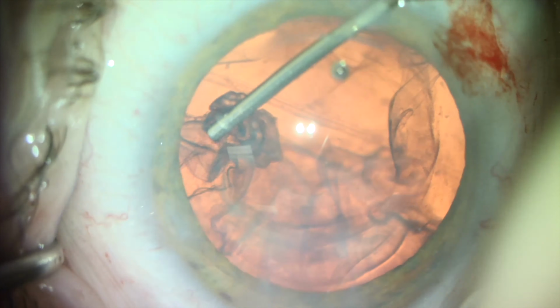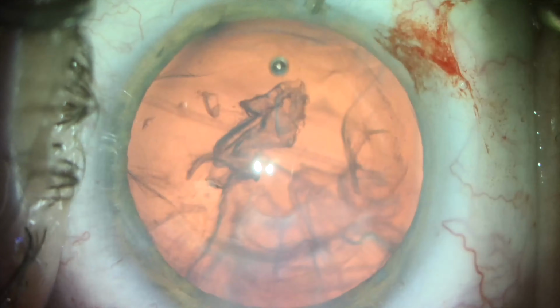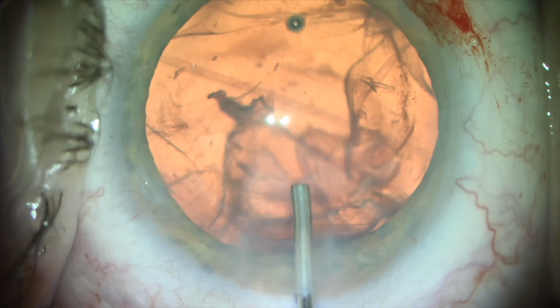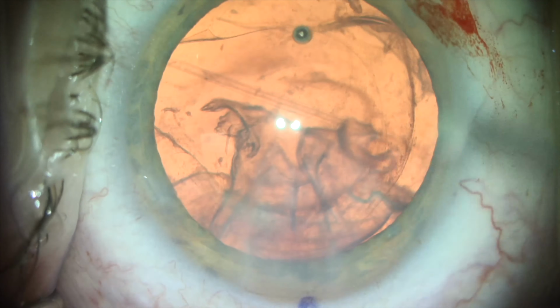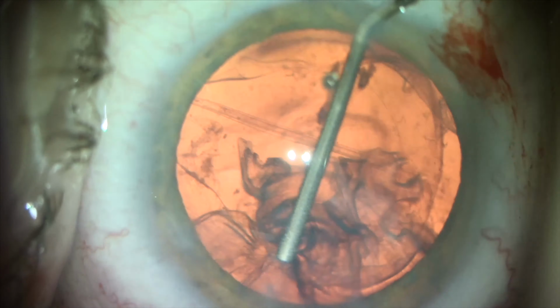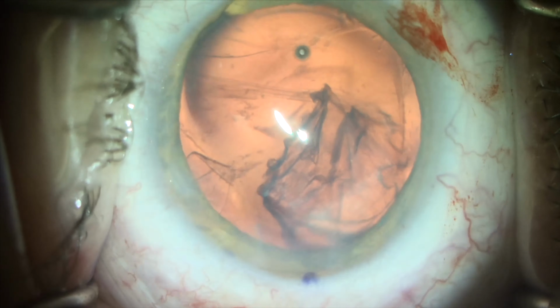I'm infusing generous amounts of viscoelastic into the capsular bag to keep it expanded. And then I use the same viscoelastic cannula to aspirate the remaining cortex in a super controlled manner from the capsular bag. In my mind, in this particular circumstance, I have the greatest amount of control by removing the cortex in this manner. Irrigation and aspiration would remove it, but there would be turbulence which might cause some of the cortex to move posteriorly. It might bring vitreous into the anterior chamber.